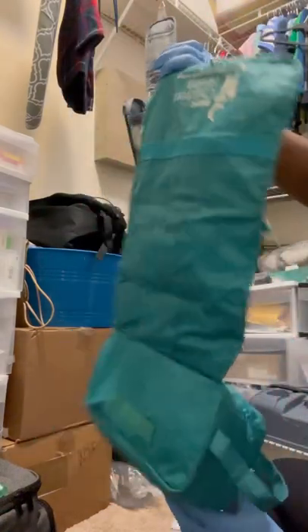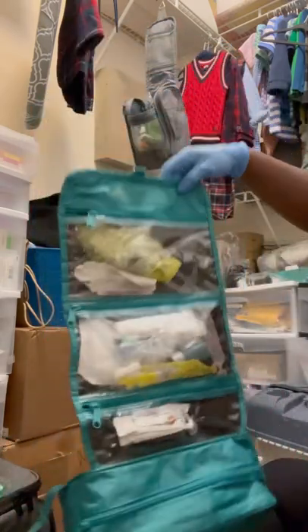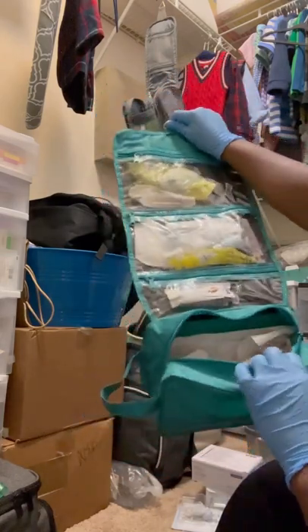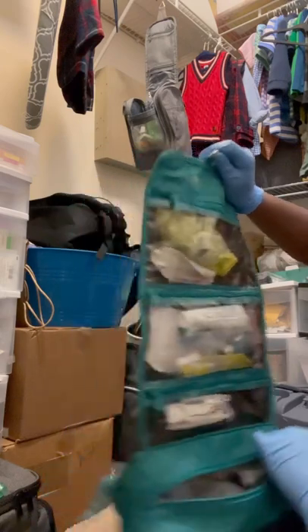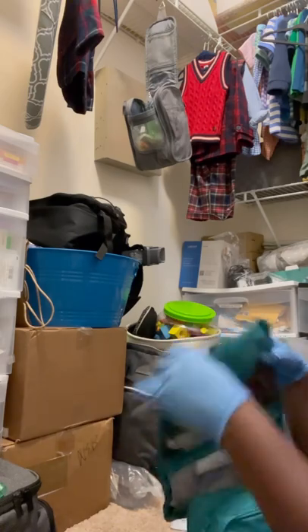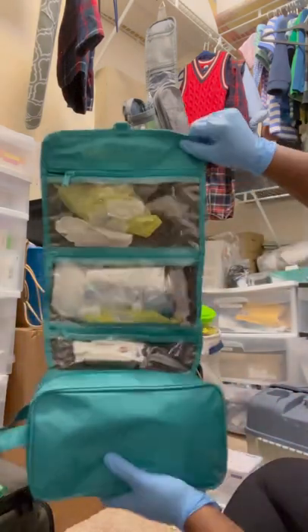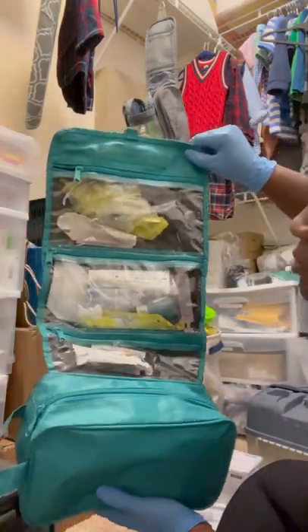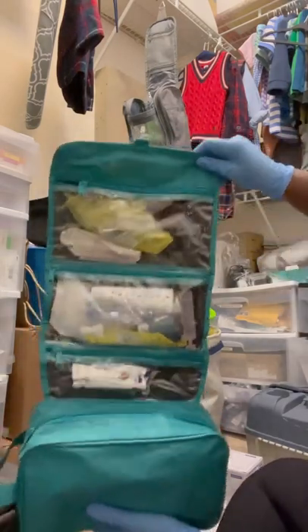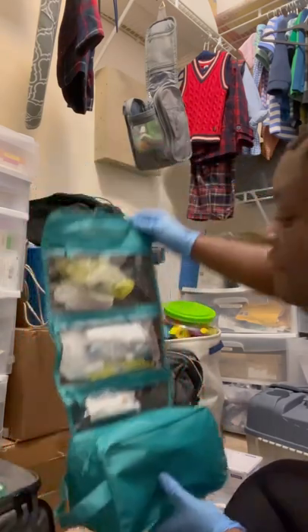This trach bag was provided to us from the hospital MUSC Children's Health — that's the hospital Braylon went to. This bag has enough space to carry all types of things, but I'm going to go through it and repack it. This bag stays in the car and it is our emergency trach bag. We have another one at home, but this is the backup emergency trach bag that goes to the hospital with us if we have to be inpatient. It goes to doctor's appointments with us. If me and Braylon are out and about, this bag is with us. Right now I'm going to repack it to make sure it has everything it needs.